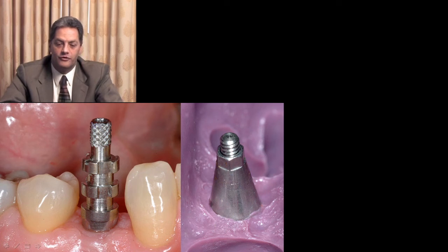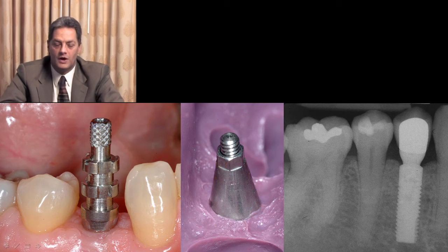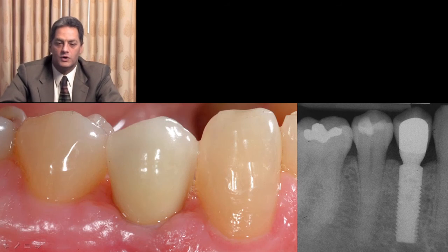In many instances, if we have the implant properly placed and the impression post has the correct profile, we may be able to go into the final restoration without having to create such a profile with a provisional restoration, as we're able to do in this particular situation. The restoration is a little bit larger, a little bit lighter, as the patient elected to do some whitening after delivering of the restoration.